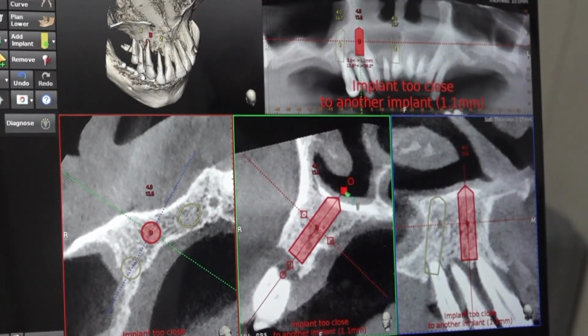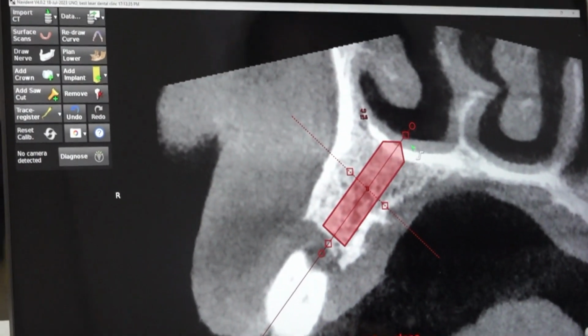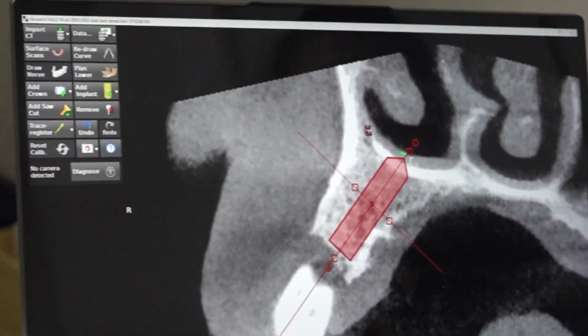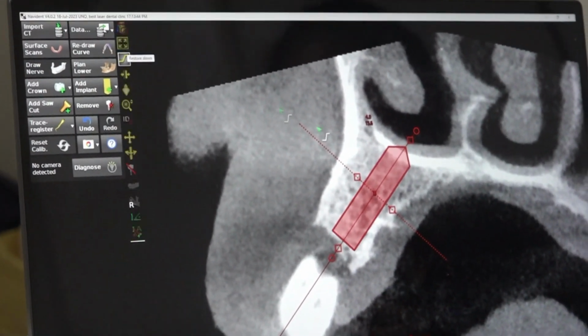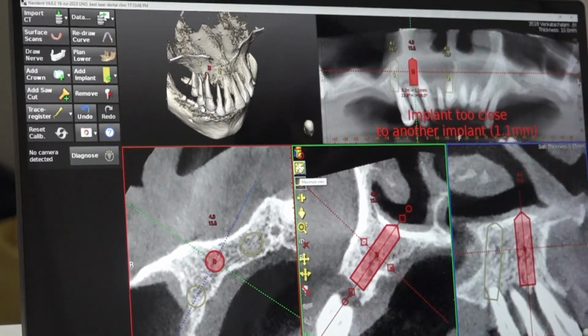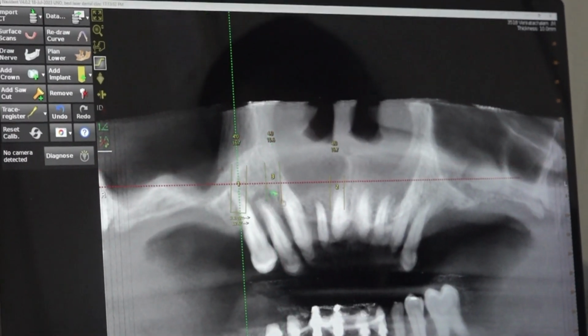Okay. So the thing is, in the software it shows they are close to each other, but in reality it may not be a problem, because here this is almost a parallel implant, but the implant we are going to use is a tapered one. So it may not be a big issue. So to avoid this implant close to each other, one technique we are doing is these two implants, no?